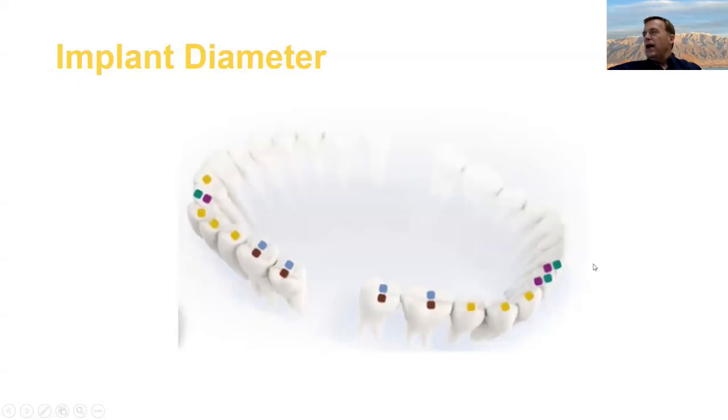So you can see, I like this. I won't mention the company, but they're the only ones I've seen that have put something like this together, and it shows how you use your really small implants here, the 3 millimeter ones we were talking about. You do your 3.25s, your 4s here, and this is where you use your 4.5s, 5s, 6s, so that not only is there more load there, but we also get that nice emergence profile so our crown looks kind of tulip-shaped.